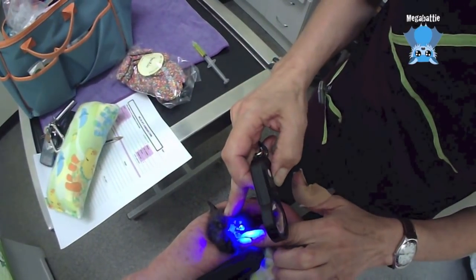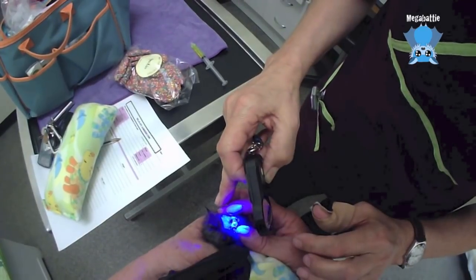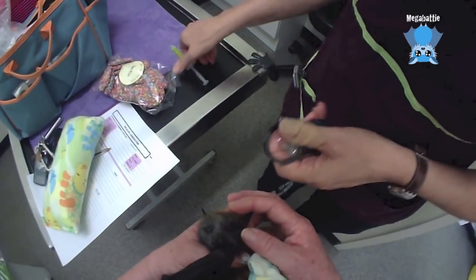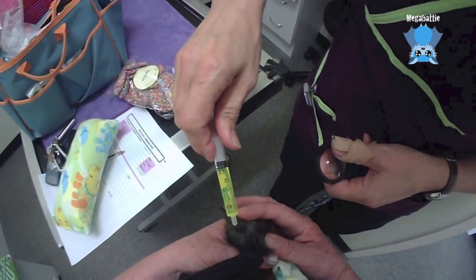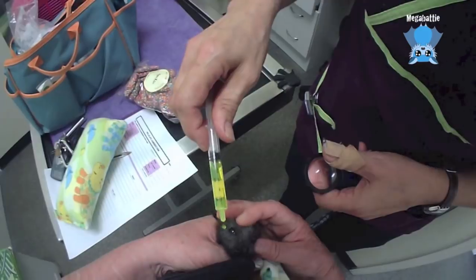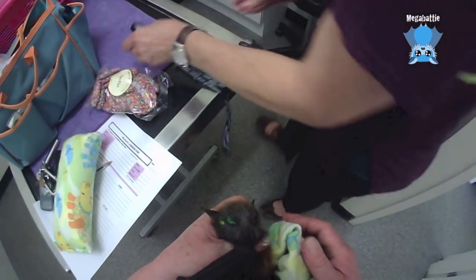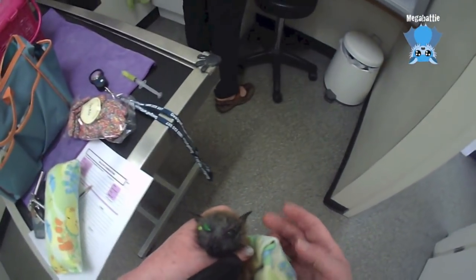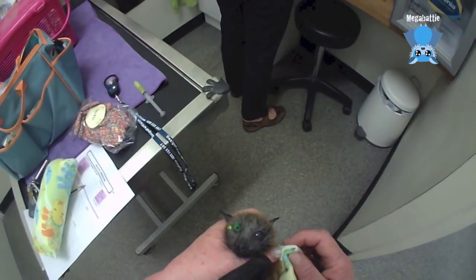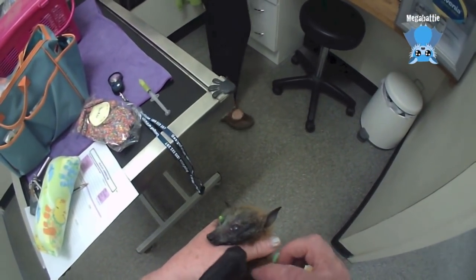You can see there's this area of eye that shines bright green. This is a fluorescent dye that stains an ulcer so that it shows us what area is damaged.